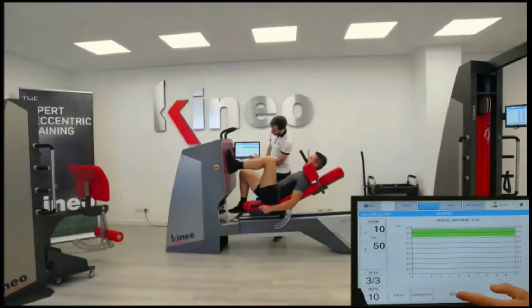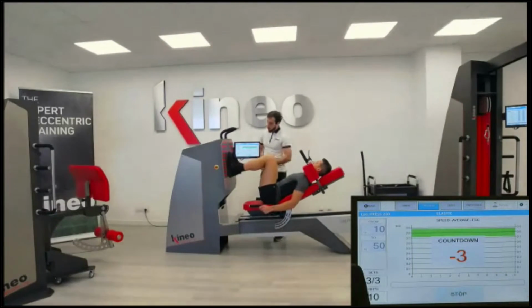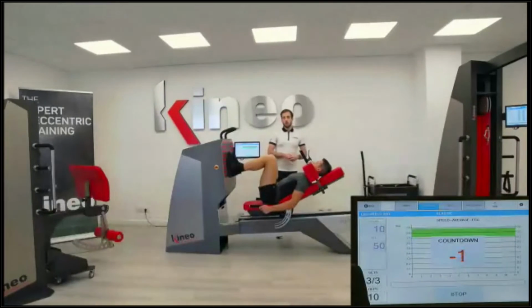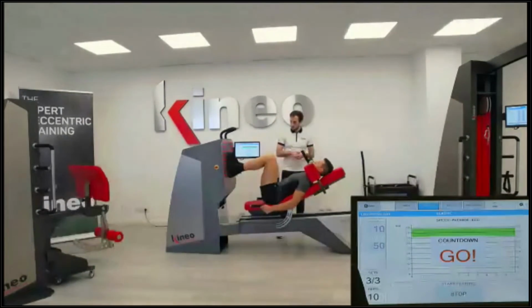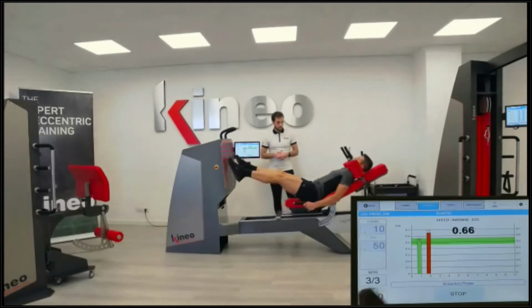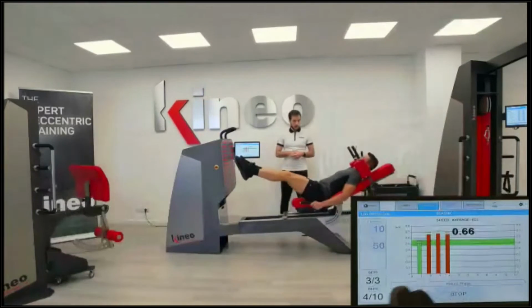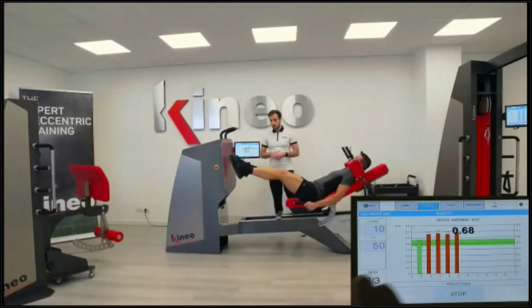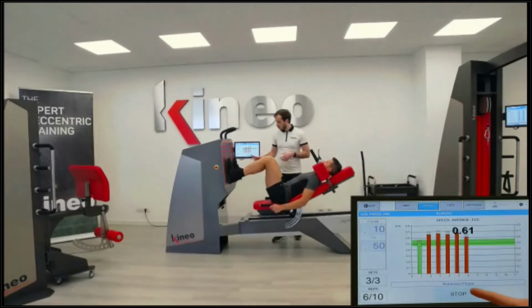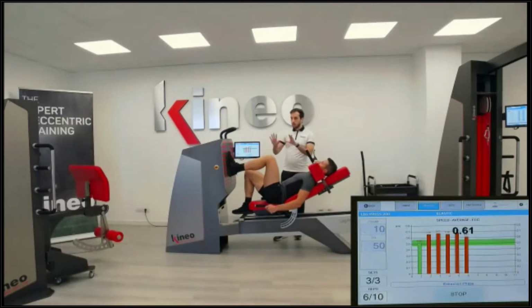Okay. So now I said to Damiano to jump with 2 legs. Of course, we can do monopodalic exercises. All right, very good. All right, perfect. So of course we can do 1 leg, we can do both legs going up and down.